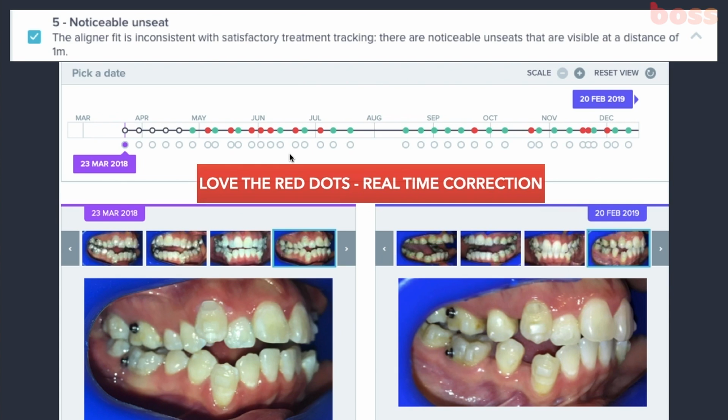It could be that the tooth movement was pretty complex and needed about 2 to 3 weeks to express. Whatever the reason, that's okay. But once it's tracking, they can move on, okay? So as you see in this photograph, an extraction case with second premolars removed, there's no dumping, there's literally teeth moving, walking, open bite closing, so it's really good progress for all our treatment objectives.